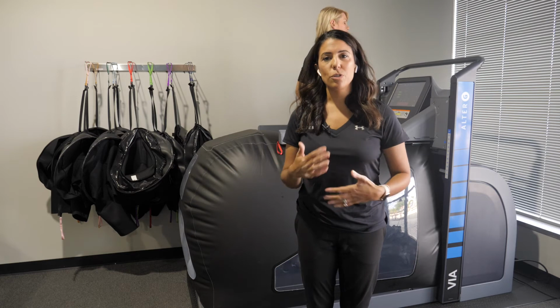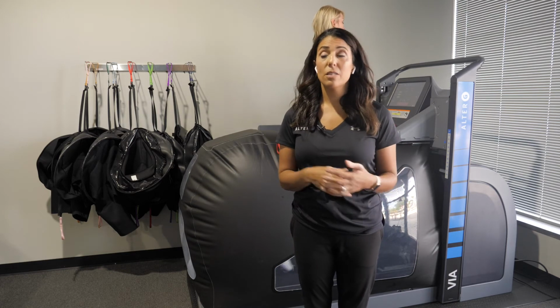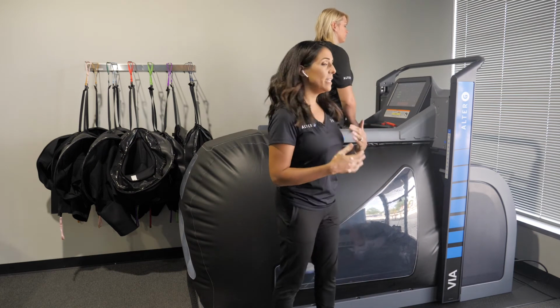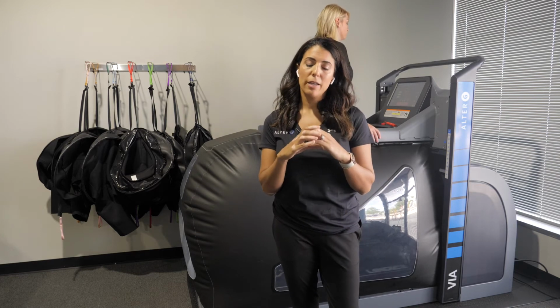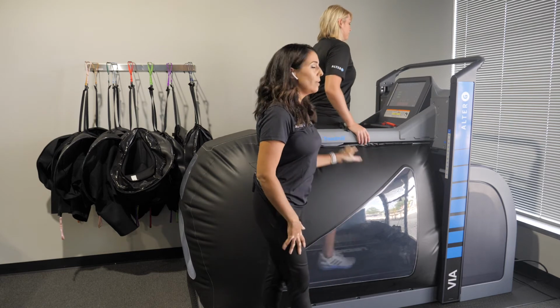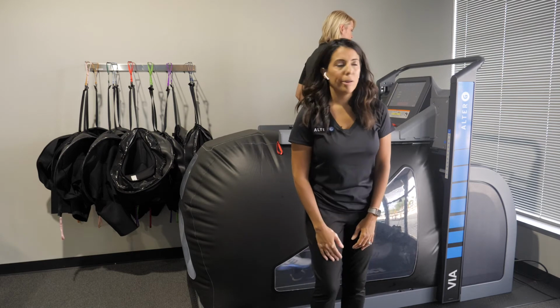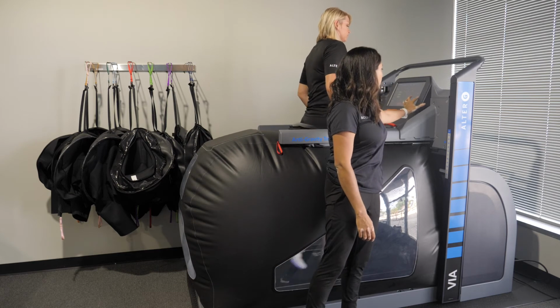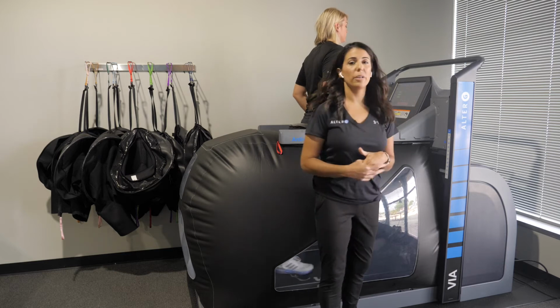So all these overuse injuries, there's various ways we can use these parameters to really help our patients to maximize outcomes or to just give them some feedback. At any point while my patient is walking, I can actually record and take a snapshot of their symmetry with certain parameters. So right now I have Katie walking at 84% of her body weight, and she's walking at 2.3 miles per hour. I can reduce her body weight, let's say to 75%, and I can click record gait data.